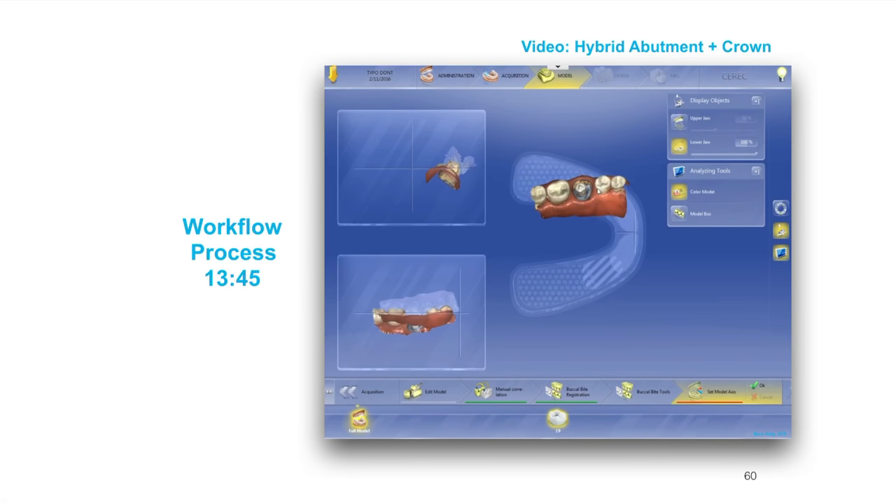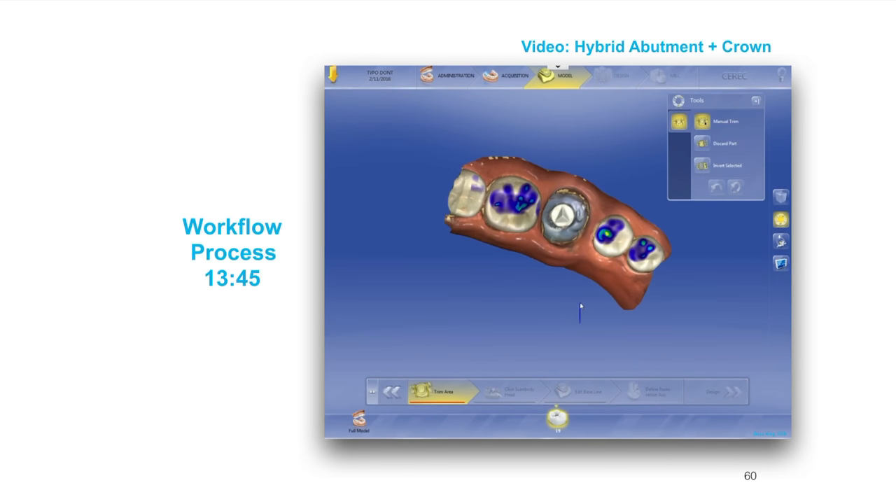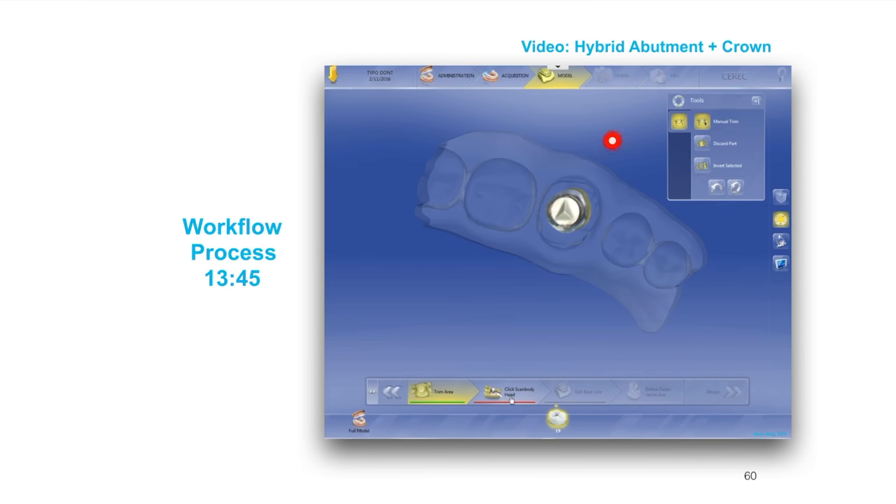Next step: set the model axis. I'm going to position it where I need it to be and rotate it so that the occlusal plane is roughly in line with the horizontal lines here. Generally speaking you've got an area for molars, premolars, and anterior teeth. Then you hit set model axis and confirm. Then we're going to trim the area. Some docs go in and trim out like this, and others will just circle around the tie base. Either way works — I'd suggest being as conservative as you can because you're going to get a trough all through there.